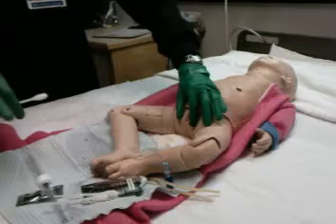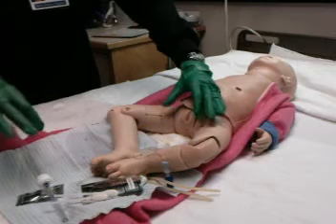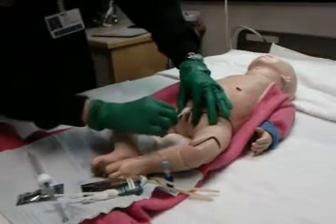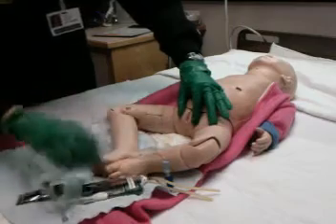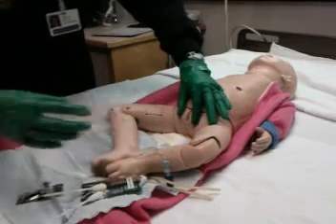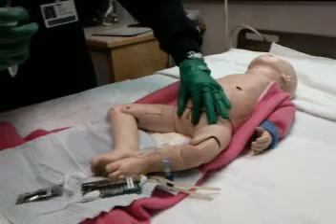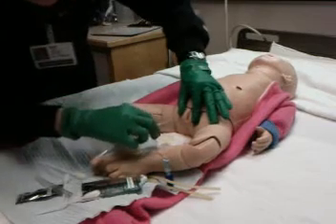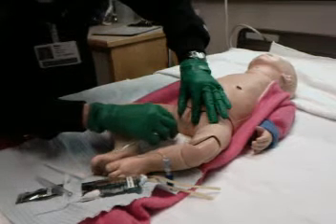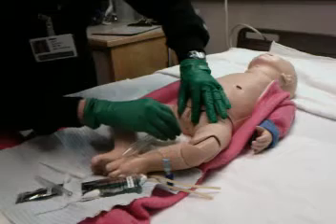After Beth and I reviewed the last segment, you could see in general how things look. What you will see now is just me doing the swabbing of the baby's labia and meatus, and then also putting the catheter in so you can actually see what it looks like. You swab down, and you can go down both sides, but remember on the baby everything is in the same general location — it's not as if you have to make sure you're down one side and then the other. Make sure the lid is a little loose. You can see the urethral opening, and then you just go in. I would also have had lubricant on the catheter before inserting it.